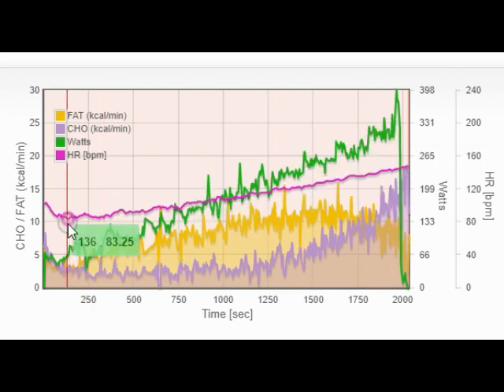So what's my cardiorespiratory response to that? We're going to see that with the CPET. Here my heart was beating 83 beats a minute to cover that 50 watts I needed to ride. But you can see that goes up as the wattage goes up, the stress goes up, heart rate goes up, cardiopulmonary requirement goes up to a point of about 90% of my max, 147 beats a minute.